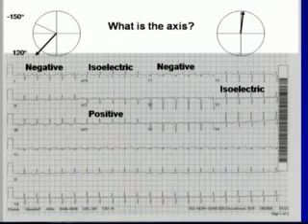Now the threshold for pathological right axis deviation in adults is 105 degrees. There's nobody isoelectric at 105. So in order to call a pathological right axis deviation, I like to see AVR very nearly isoelectric or isoelectric. You see that, and automatically you think, I wonder if this is right ventricular hypertrophy, or is there a lateral myocardial infarction?